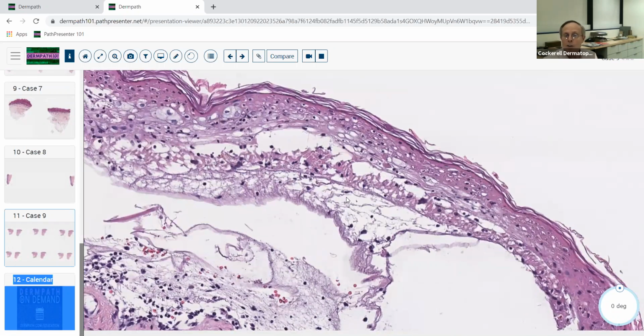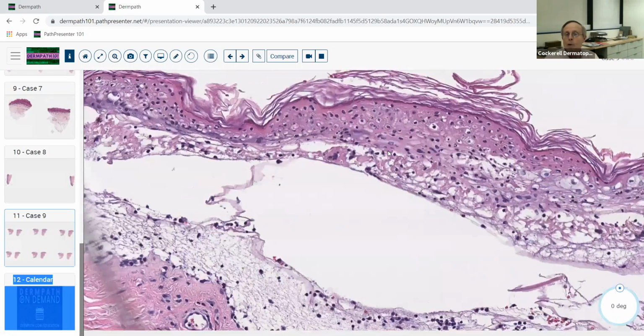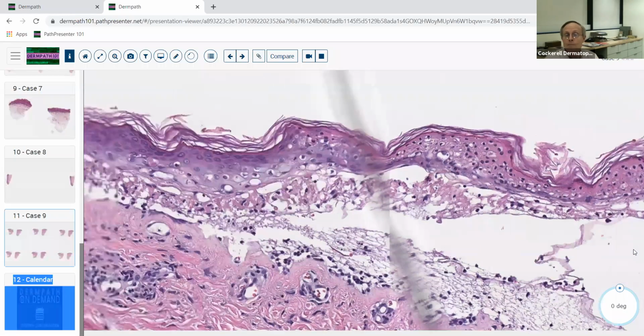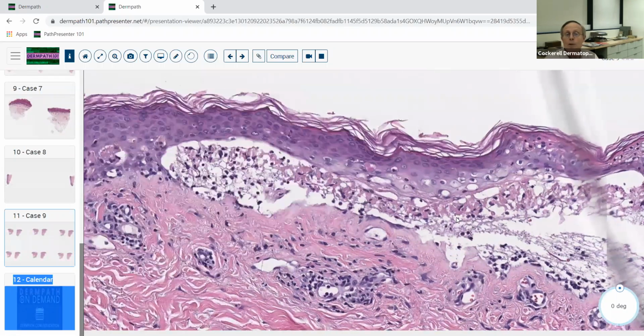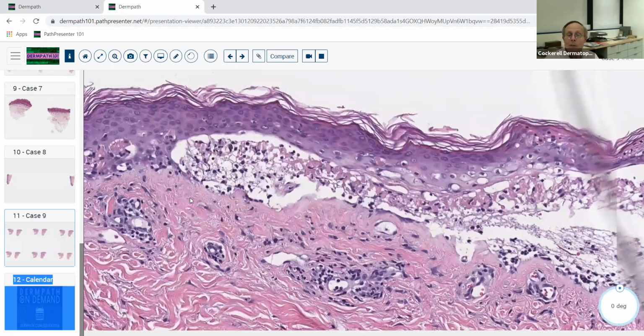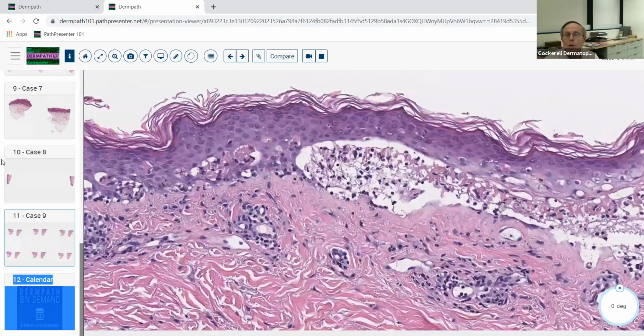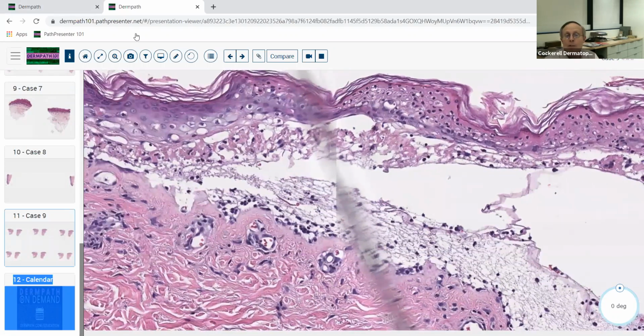So this is also in the family of erythema multiforme. This is Stevens-Johnson syndrome, erythema multiforme major. You start off with vacuolar interface dermatitis, and then it kills the entire epidermis, and then you've got this confluent epidermal necrosis over a broad front with an overlying basket weave cornified layer. So anyway, just wanted to show you the same process. And if you look here, it's early, and you can see it's morphing into a more fully developed lesion as we get close to the area.